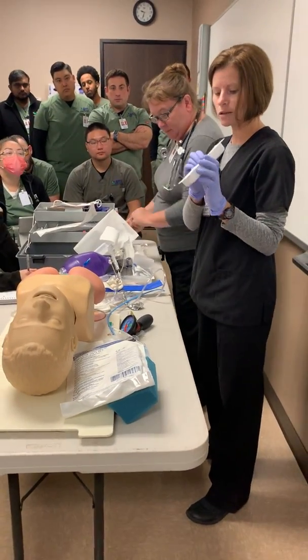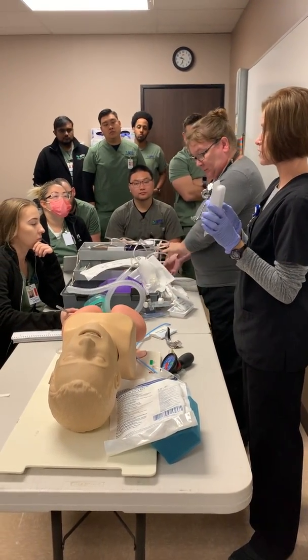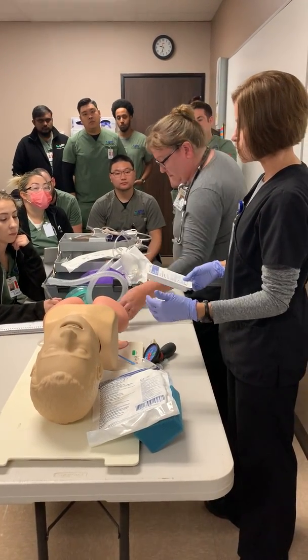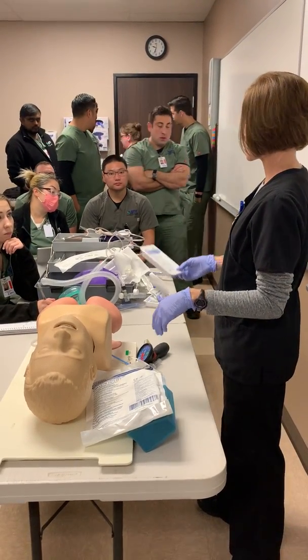As you look at the packet, this one says it's a 14 French. In the hospital, for adults, we usually use 12 or 14 French catheters. When we're going into a room, before you open this and get started, you want to make sure you have your suction source, that it's on and it's working.